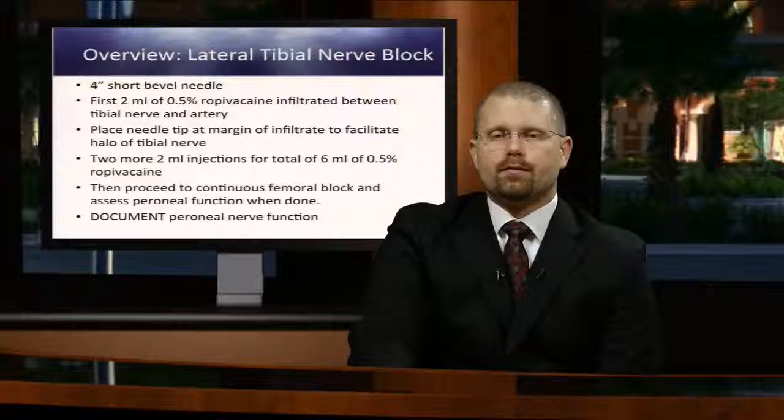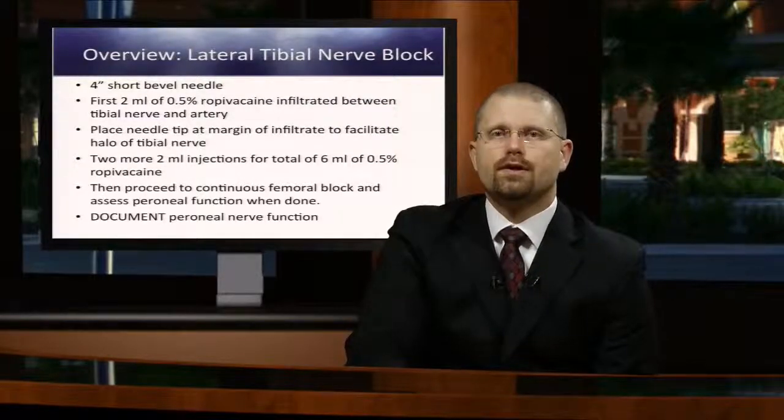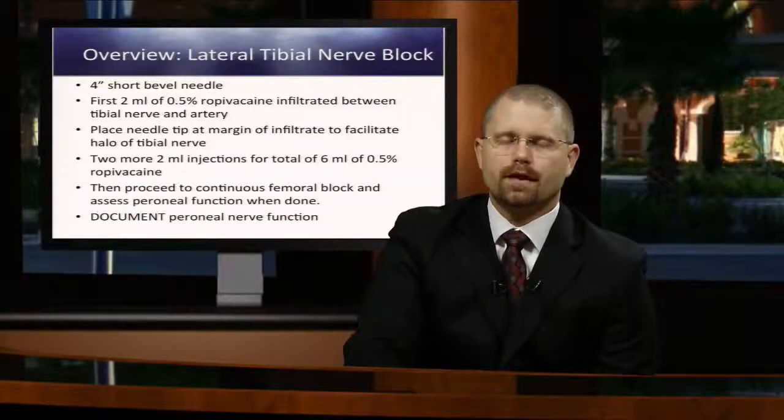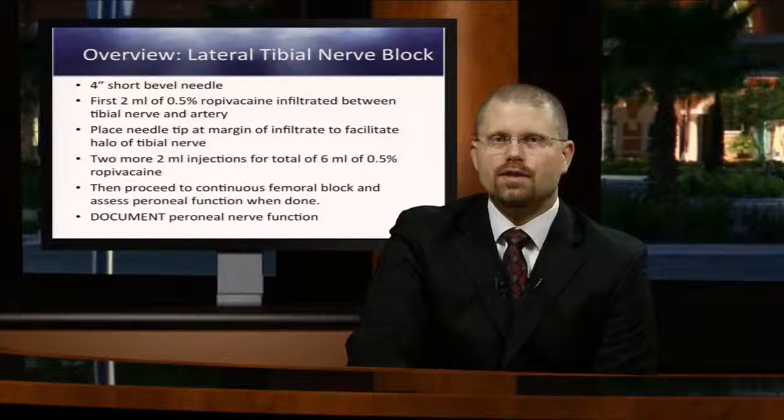Again, proceed to the femoral nerve block after you've done the tibial nerve block, and then assess peroneal nerve function when you have completed your femoral nerve block and document. If you do not document peroneal nerve function, this is all in vain. You need to document it for medical legal reasons.